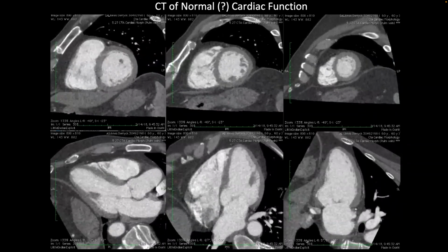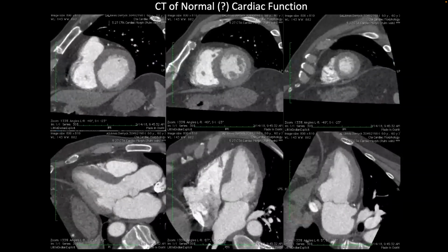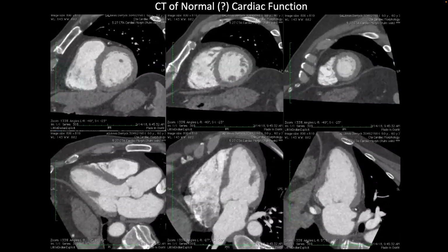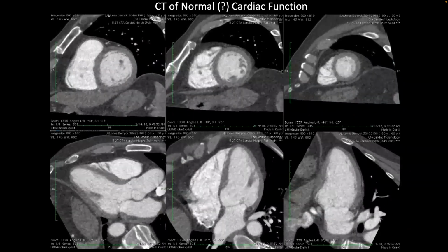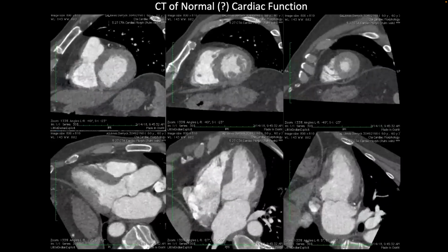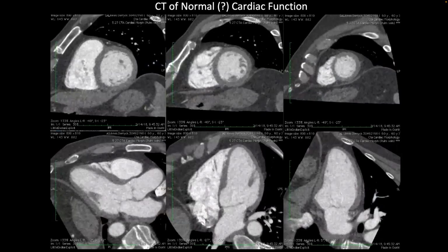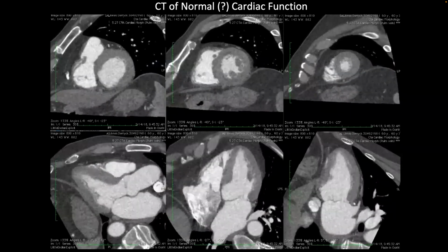Echo did not call this person abnormal, right? I guess you could get infarcts in the septum. Yeah, sure, because, well, it's basically, if you look at the left anterior descending, and if I look at my heart as a bullseye, at 12 o'clock I have the anterior wall, and then at 11, 10, 9 o'clock, I have the anterior septal wall. So on the anterior septal wall, that'll be the LAD or one of its side branches, right?